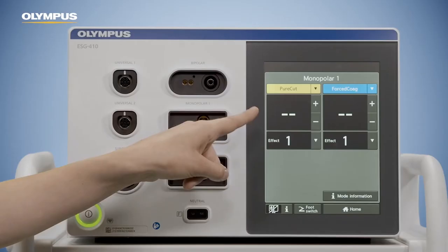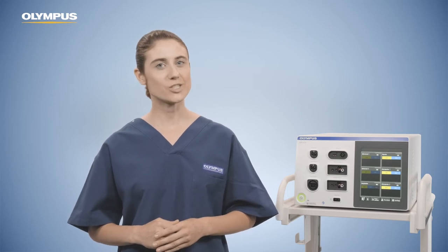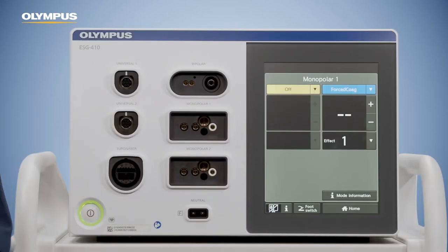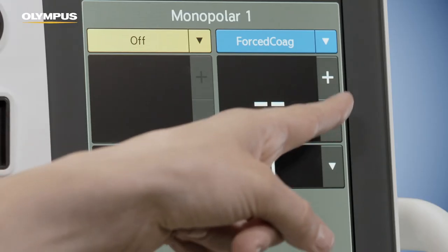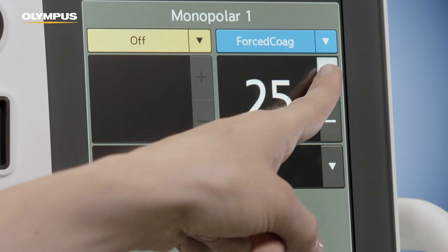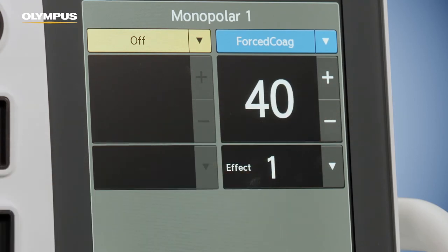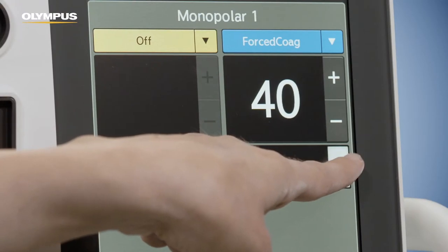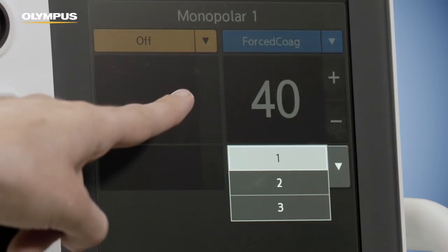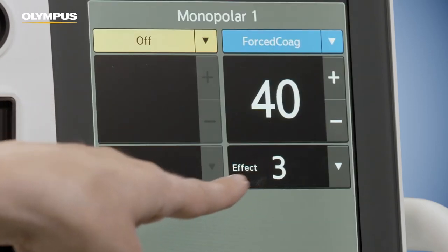You can also switch the mode off completely to avoid unintended activation. For the mode you selected, you need to set power and effect levels. By doing so, you can change the strength of the tissue effect. Please adjust the maximum output power by pressing the plus and minus buttons accordingly. You may also change the effect level. If the tissue effect is not as desired, increasing or decreasing the effect level is the fastest way to improve the tissue effect.